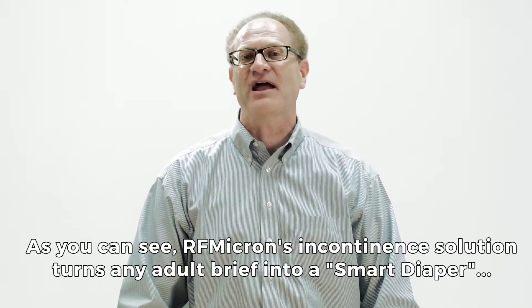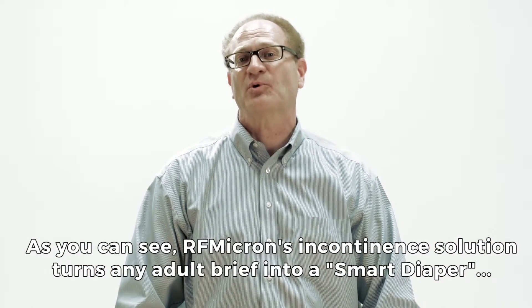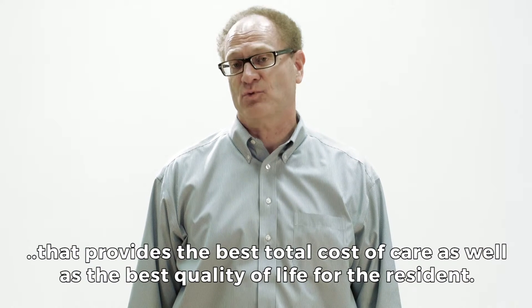As you can see, RF Micron's incontinence solution turns any adult brief into a smart diaper that provides the best total cost of care as well as the best quality of life for the resident.